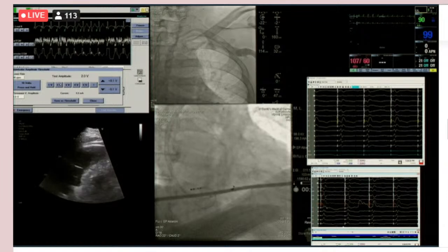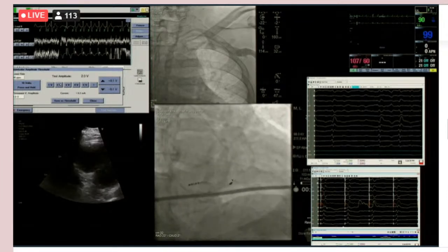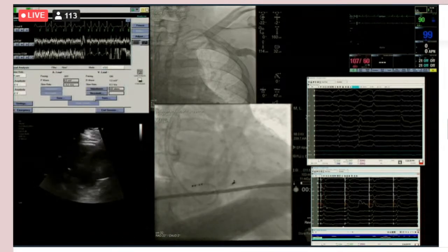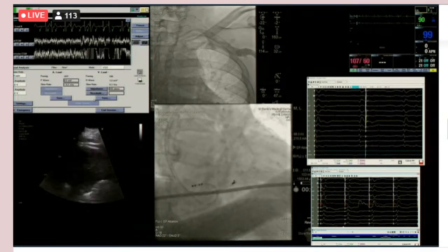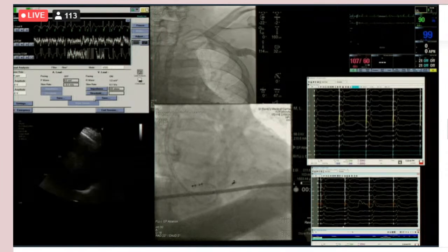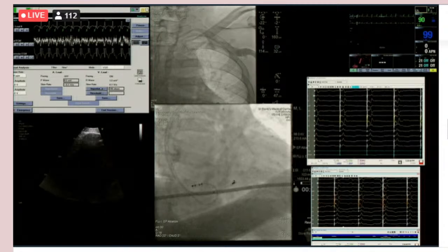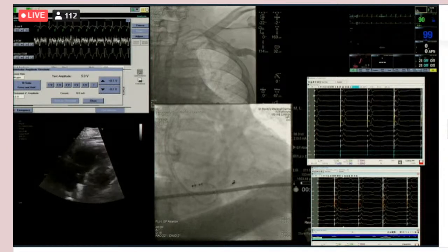And if you put in an atrial lead, do you usually put in the same type of lead, or do you use the other lead? Sorry? If you put in an atrial lead, will you use a 3830 for that to kind of match them, or doesn't it have to? I don't. I used to. What's the impedance? 536.